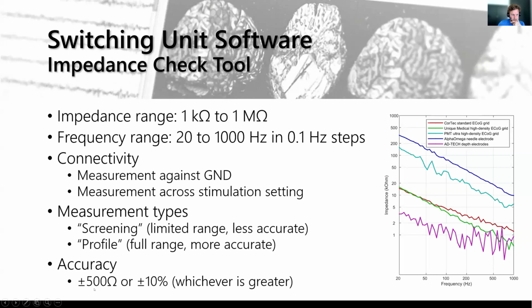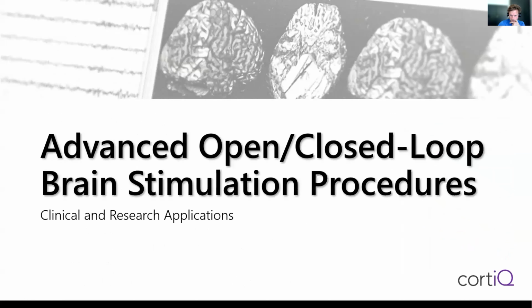Good. And the accuracy is also quite nice. We have plus minus 500 ohms or plus minus 10%, depending on what is greater. So the results you get are usually quite reliable. Good. So that much about tech specs and our equipment.